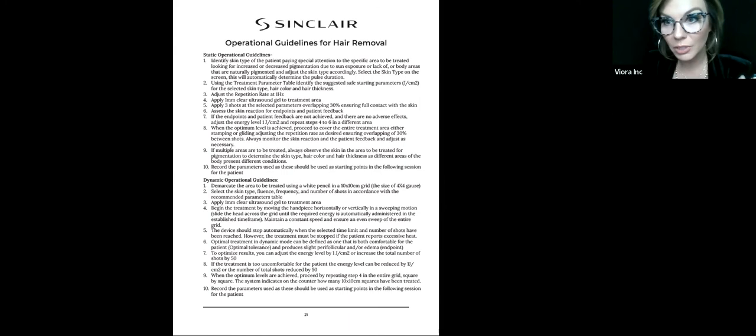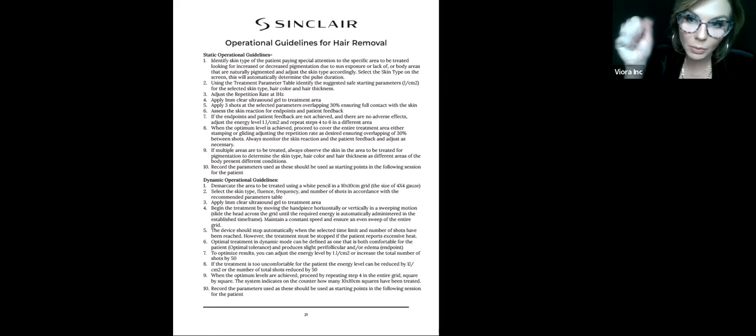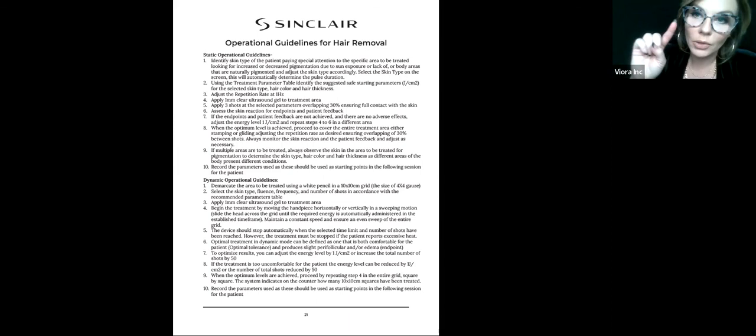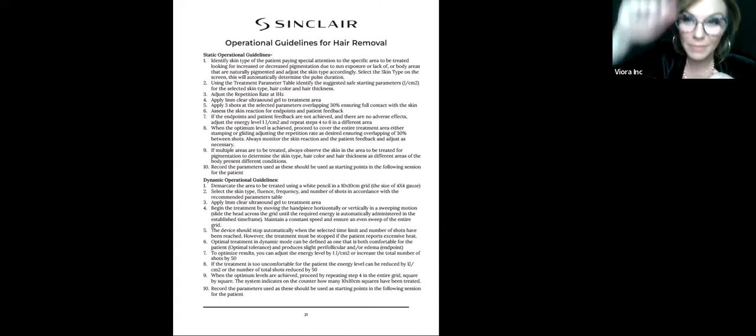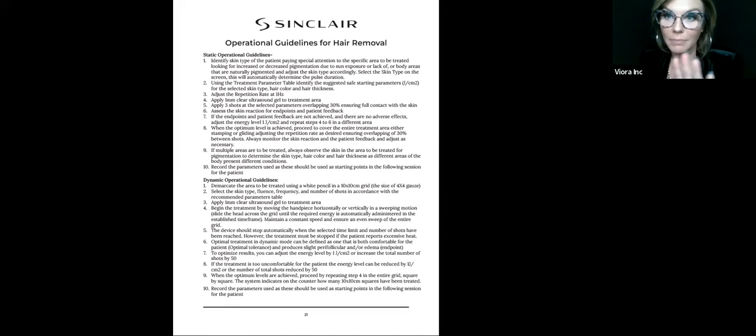So avoid moles. And if they have a lot of moles, you can just use a white eyeliner pencil and white them out, because when you go over them, the white will just reflect the heat away from the mole. So that's a little trick that you can do. White eyeliner pencils are very important when you're using dynamic mode, but even in static mode, when you're gliding, it's great to make lines to keep yourself straight and not miss areas or overlap areas too much. So a white eyeliner pencil is an amazing trick.